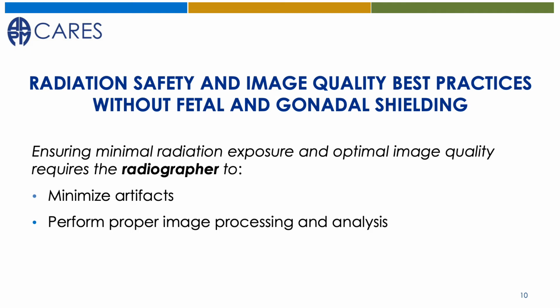It is also extremely important to utilize proper image processing protocols. Correct algorithms must be used when processing the digital images, and post-processing collimation should never be used in place of collimating to the anatomy of interest while positioning the patient.